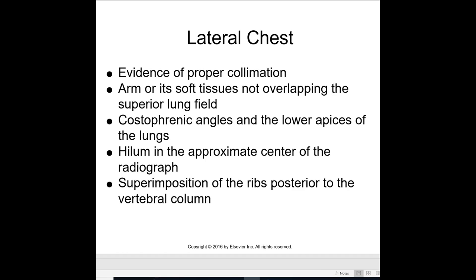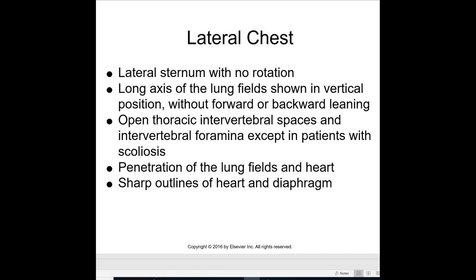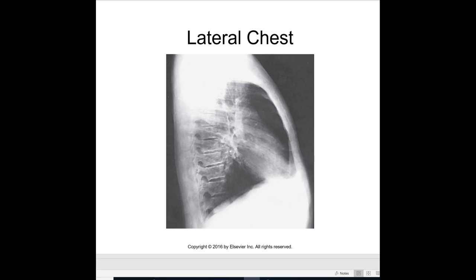For the lateral chest, evidence of proper collimation includes: arm and soft tissues not overlapping the superior lung field, costophrenic angles and lower apices of the lungs visible, hilum in the approximate center of the radiograph, superposition of the ribs posterior to the vertebral column, lateral sternum shown with no rotation, long axis of the lung field shown in a vertical position without forward or backward leaning, open thoracic intervertebral spaces, and penetration of the lung fields and heart. Looking at this lateral chest x-ray, there is no rotation of the ribs, the vertebrae are in alignment, and you can see the outline of the heart and the costophrenic angles.